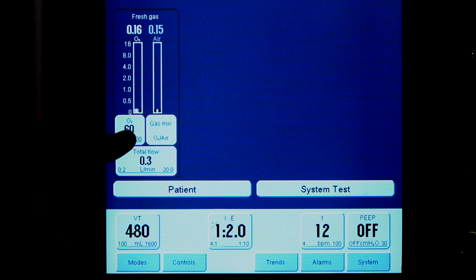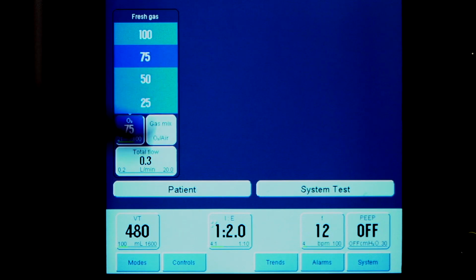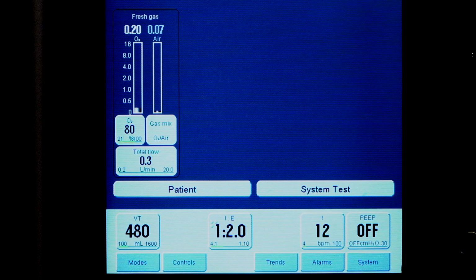Next thing you want to set is what you want the desired FiO2 to be. Again, you can click on this and you'll notice it gives you some quick pre-selects of 25, 50, 75 and 100. So if I wanted to pick 75, I'd click that. I'd see that it's highlighted and I'd choose it. I can also click that and rotate the button and choose a different FiO2.